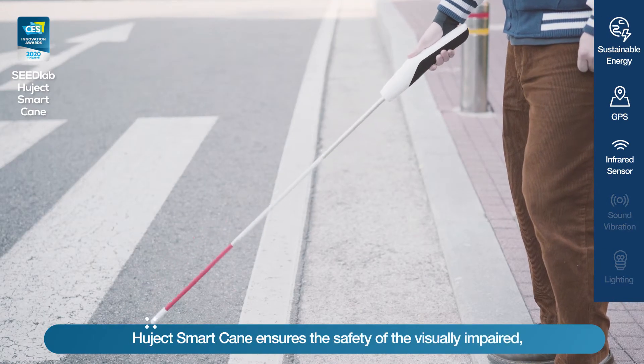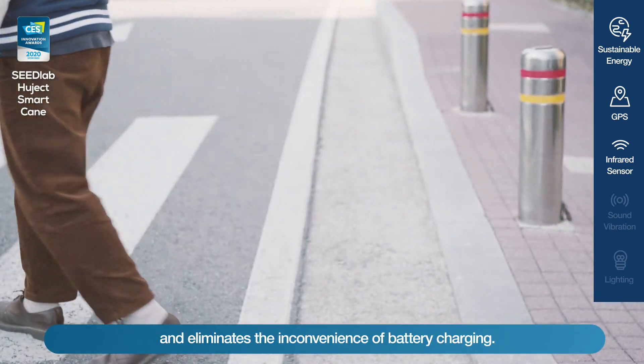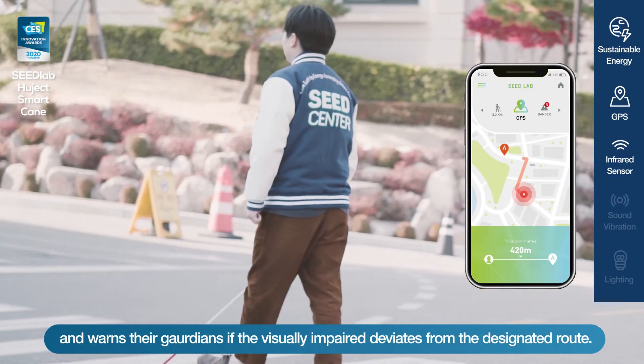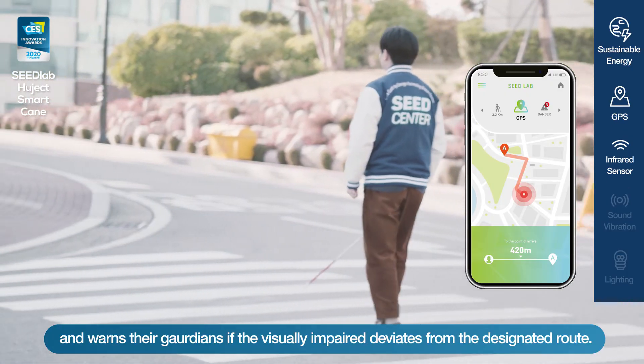Huject Smart Cane ensures the safety of the visually impaired and eliminates the inconvenience of battery charging. The GPS module periodically checks the current location and warns guardians if the visually impaired deviates from the designated route.